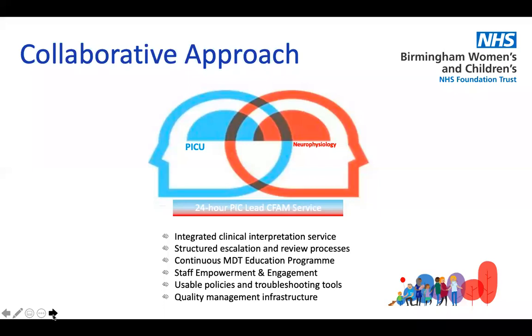So although the service at the Children's Hospital is a 24-hour service, which is the full responsibility of the intensive care unit, we do have a fantastic support network with neurophysiology. So they will support us in giving us this governance, education and continued programme of CFAM that we're able to run. But ultimately it remains our responsibility, and they will support us through that process.